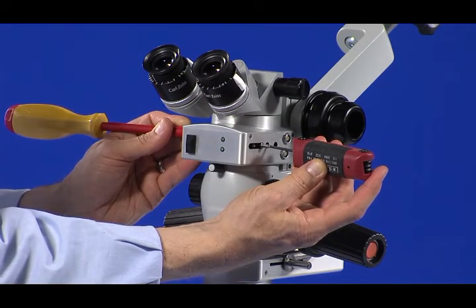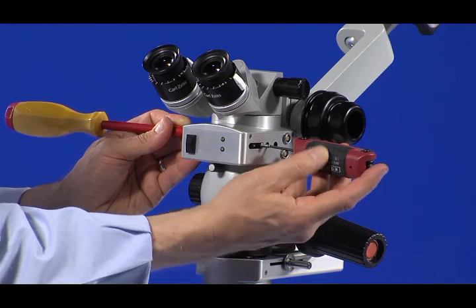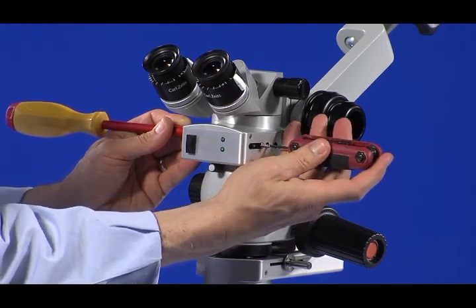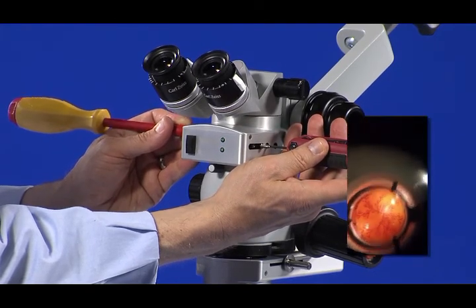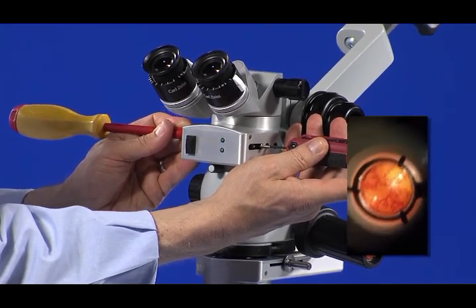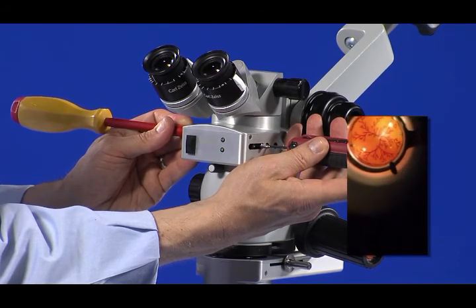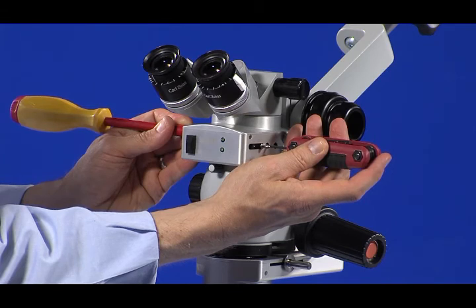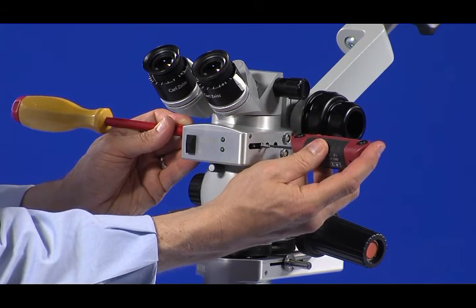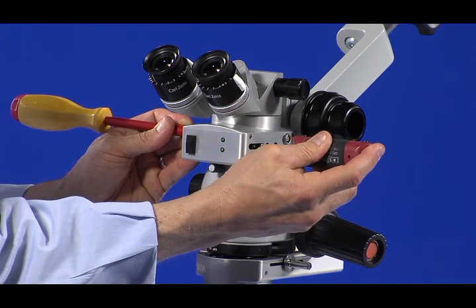First, adjust the front-to-back alignment of the prism. Access the number 1 bolt with a hex wrench and access the adjustment slot with a screwdriver. Loosen the number 1 bolt slightly — one-quarter to one-half turn at most. Gently pivot the screwdriver tip up and down to adjust the front-to-back alignment of the prism. Very little force is required and only small movements should be used. When the reinverted image of the lens is centered from front to back, tighten the number 1 bolt to lock the prism in place.